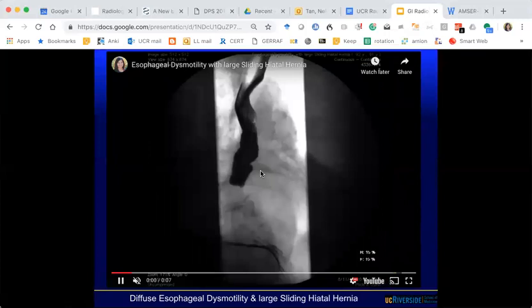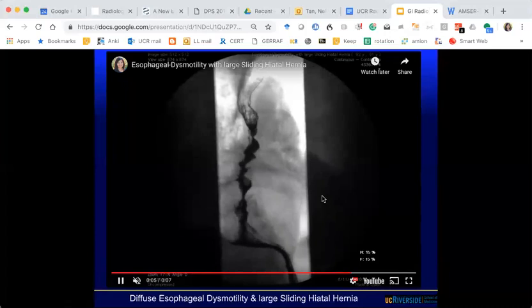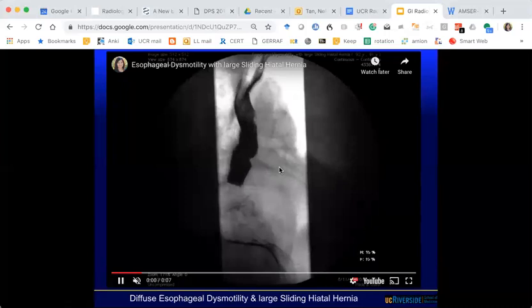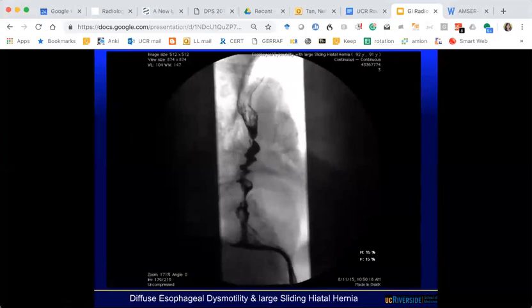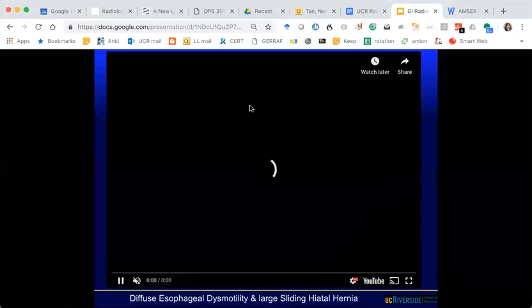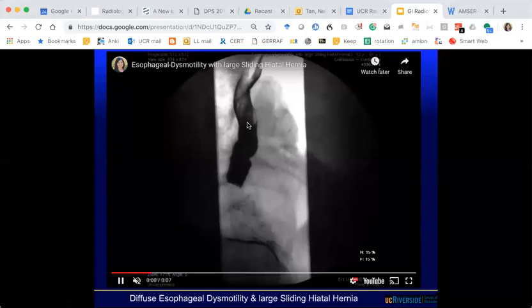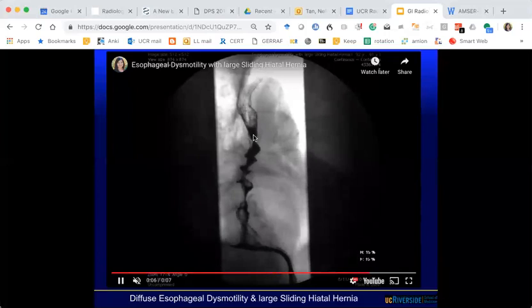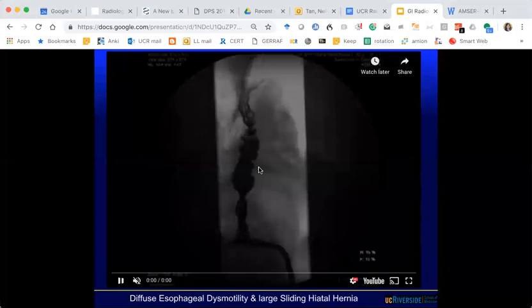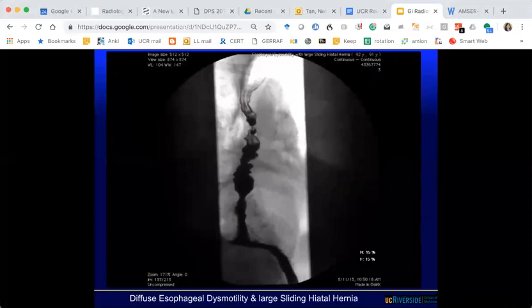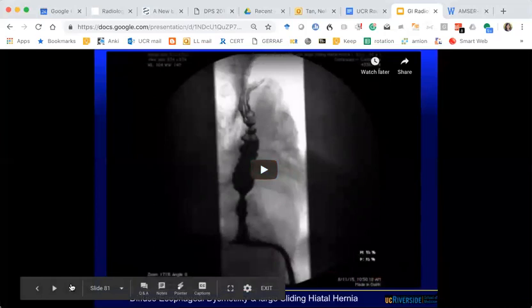In contrast, here we have a corkscrew pattern — a lot of tertiary contractions that are non-propulsive and not moving the bolus forward. This is dysmotility — peristalsis is not normal. There are different severities — patients can have severe dysphagia or dyspepsia from dysmotility. That is an example of a functional disorder evaluated by esophagram.